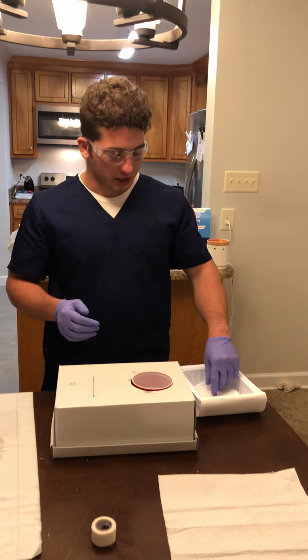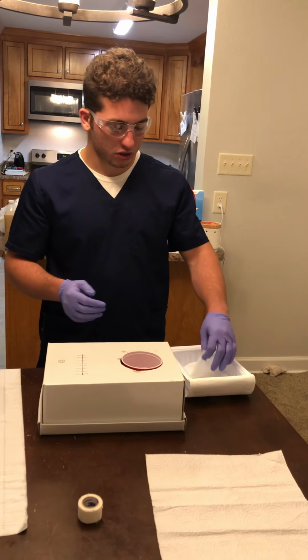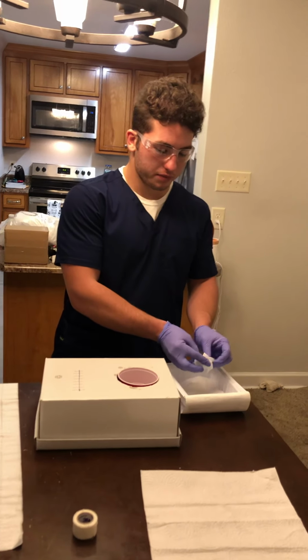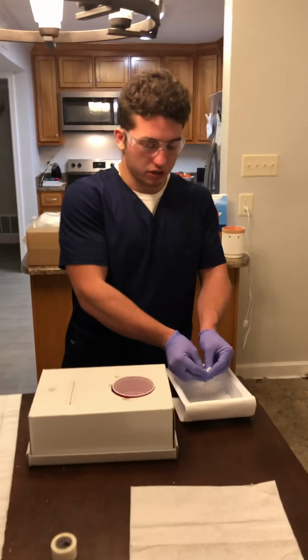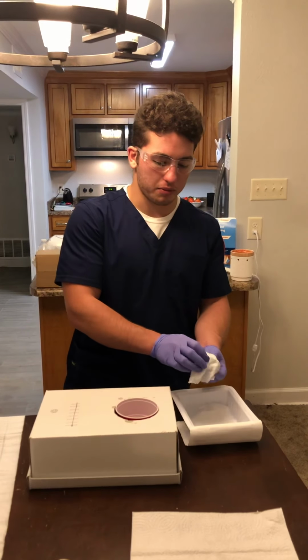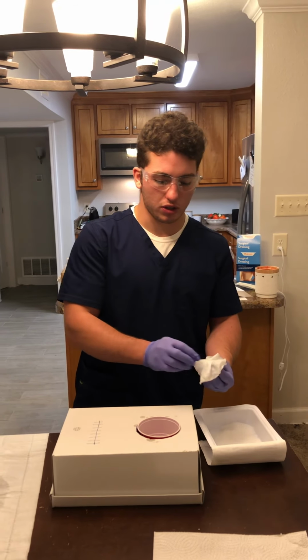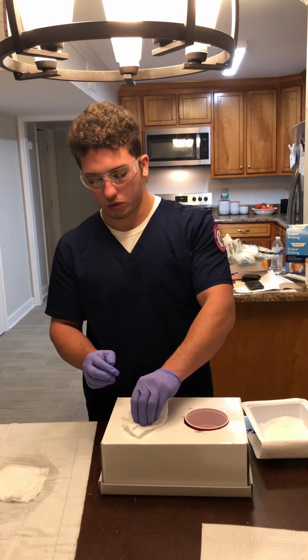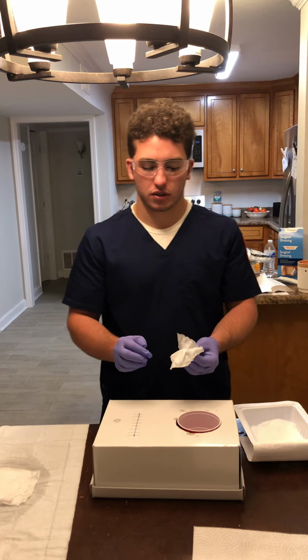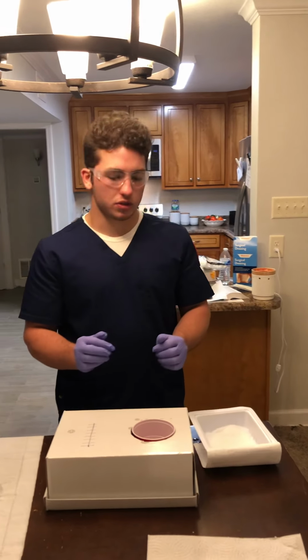So I'm going to take my soaked 4x4 gauze. I'm going to wring it out, ensuring not to splash any on my sterile field. And I'm going to hold it in my hand in a way that my gloved hand does not come in contact with the patient, only the sterile gauze. When wiped down, straight down the suture line, I'm going to dispose at waist level, drop it into the waste can.